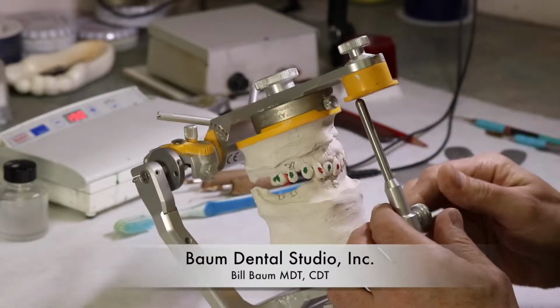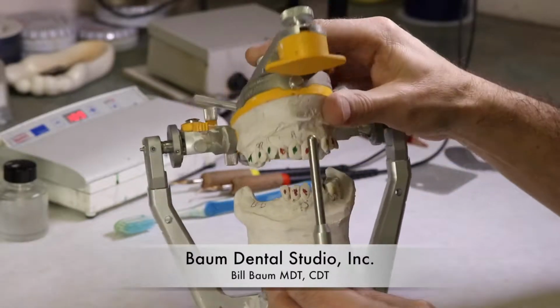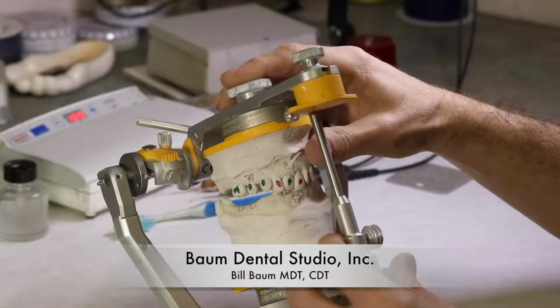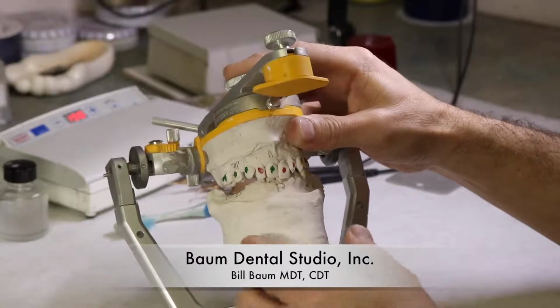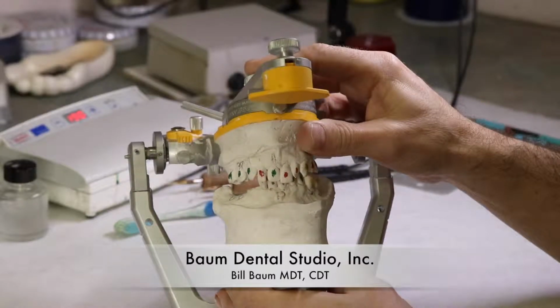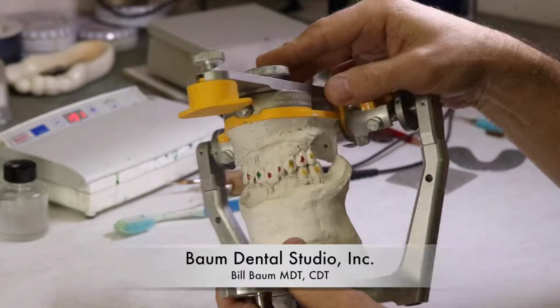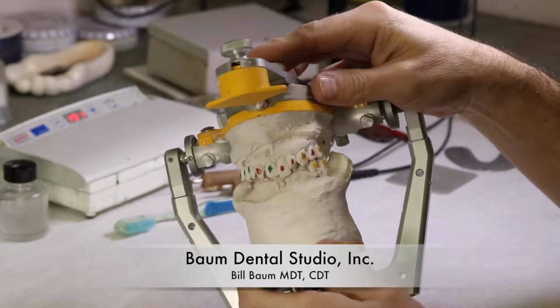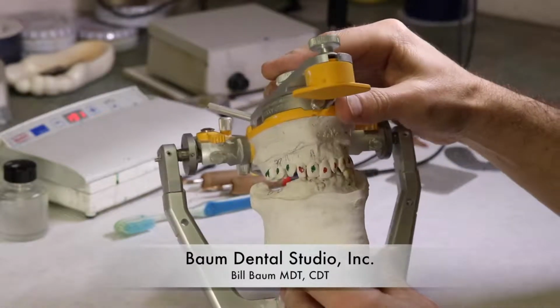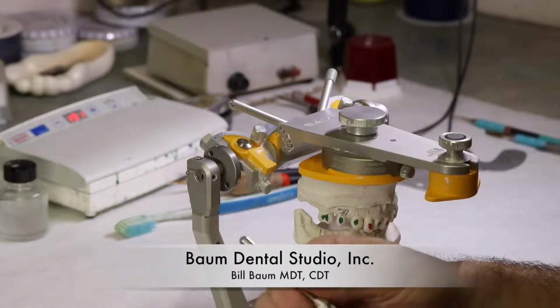on the pin. So where we are now, I'll take out this pin so we can see where we are in MI. And we can see the two centrals are at different incisal planes, and the occlusal plane is rising bilaterally, but particularly on the left side here. So we've determined that we're going to open this pin approximately 5 millimeters.